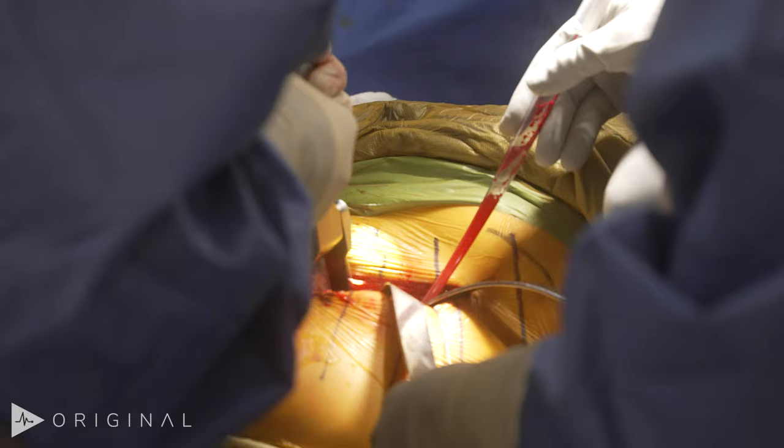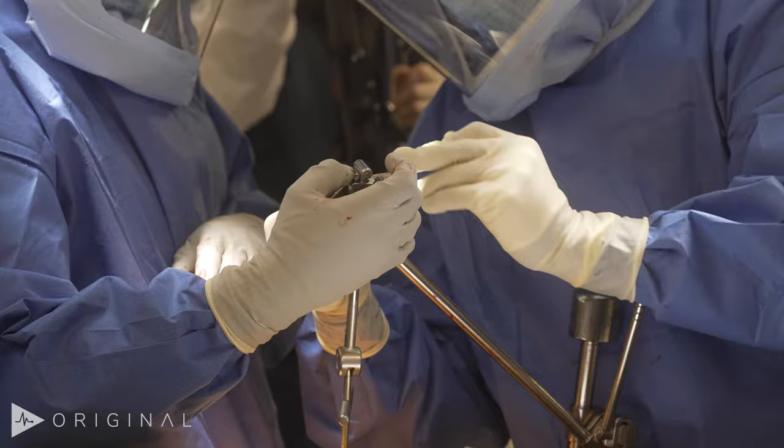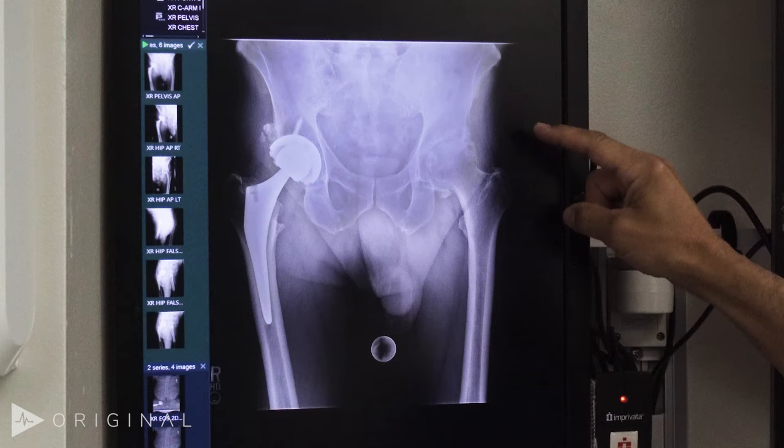We're trying to minimize any unnecessary tissue damage, and the way we achieve this is by understanding what structures will help or hinder us in achieving a particular goal.